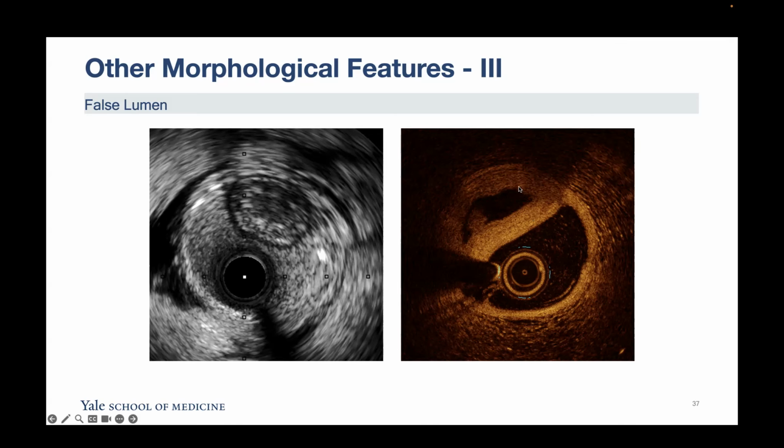So this is the true lumen collapsed, by OCT. You see here the medial layer. So this can happen even in non-CTO cases, so just be mindful. These are nice pictures, not good when you see it, but it's important to recognize those.